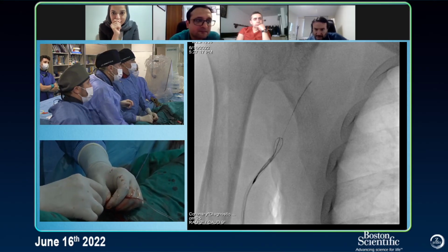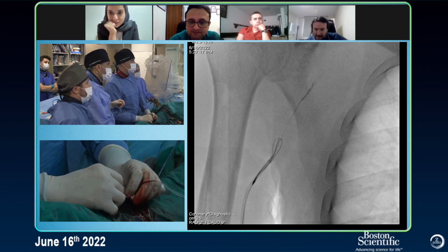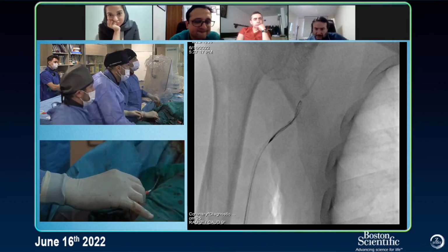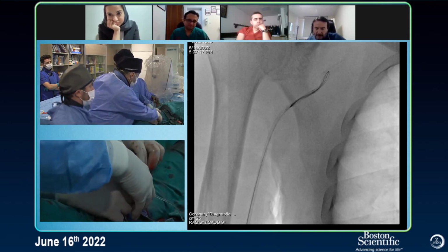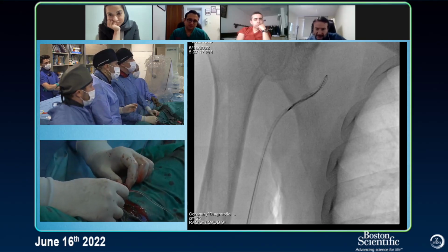All right. Uh-oh, I think you're losing the stent. It's coming closer to the tip now. That's okay. We should do it the other way around. No, it's not a problem. Let us remove this for you. Yes, it's coming with the flow.